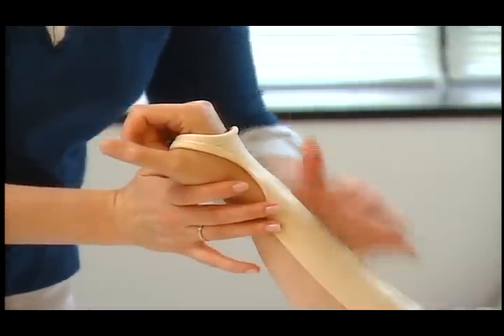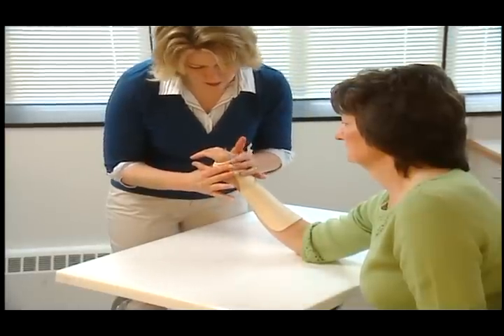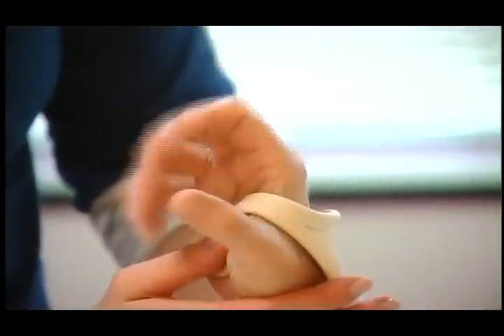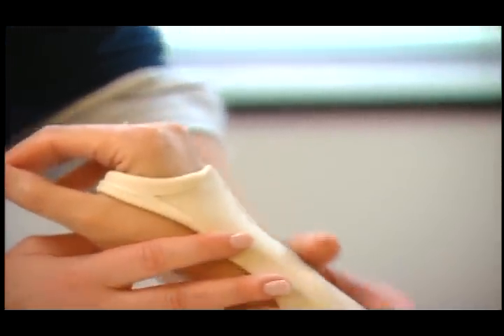Use smooth and gentle strokes to contour the splint over the arches and bony prominences of the hand. Be sure not to grip or squeeze the thermoplastic, as this can cause pressure points. As the splint is forming, it is important to check for any motion that may be unnecessarily restricted and make changes in the splint as needed.